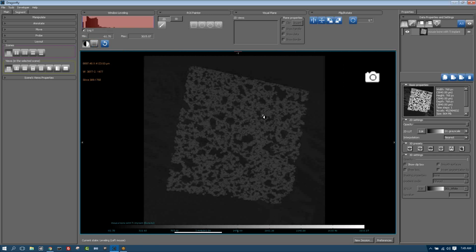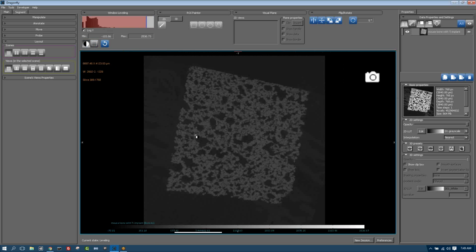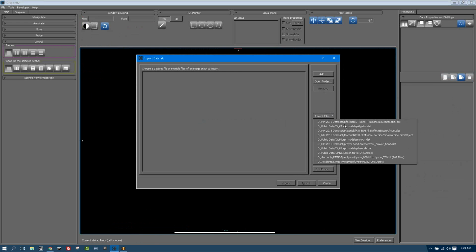This mode is the most generic, and for most users, there is a mouse shortcut that allows you to access vertical drags and horizontal drags just by holding down, for example, I'm holding down the control key and dragging on the right mouse. Okay, let me load a more relevant data set for a paleontology audience, and we'll move forward.